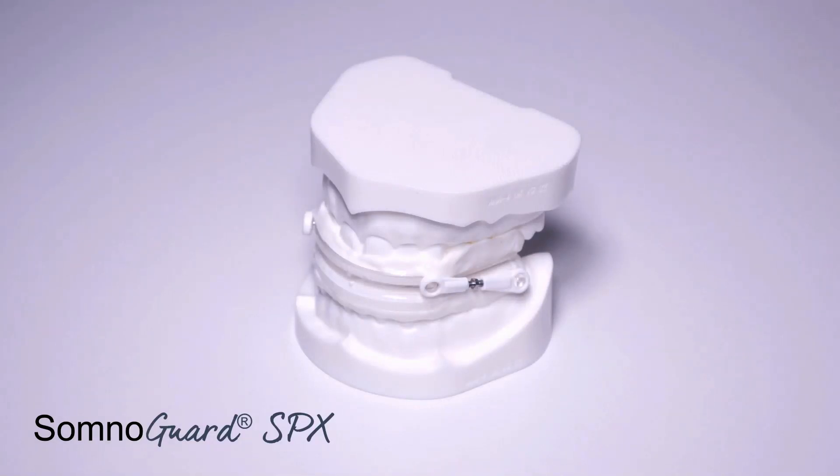In this video, we'll explain how to fit the Somnogard SPX oral appliance.